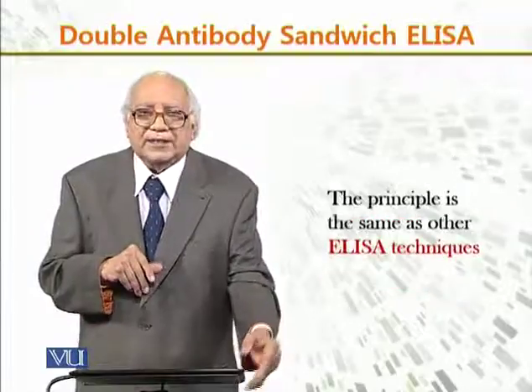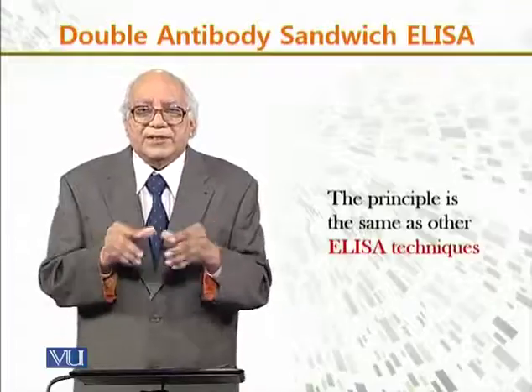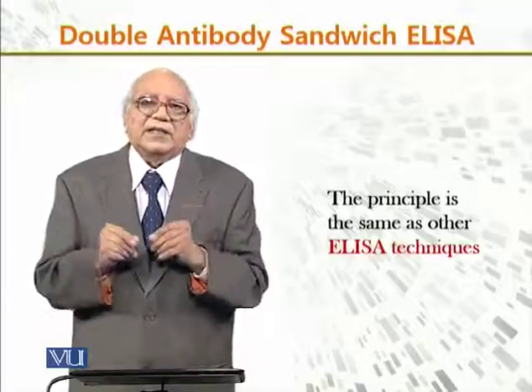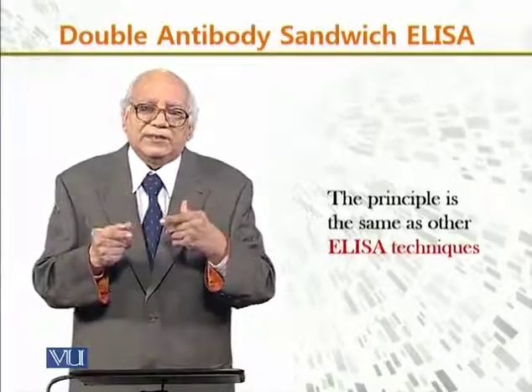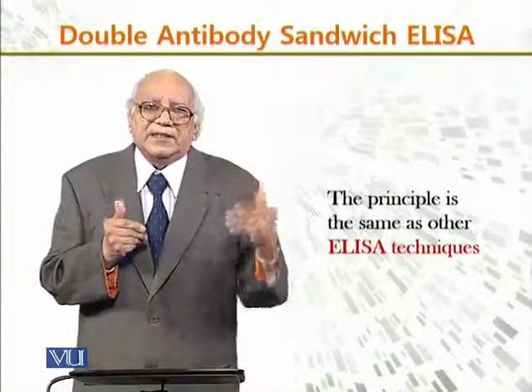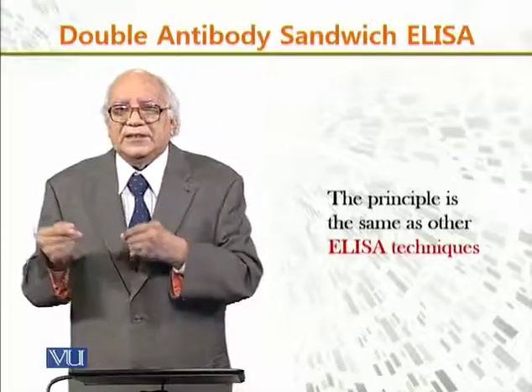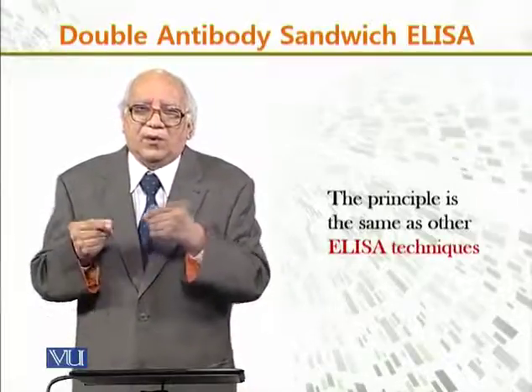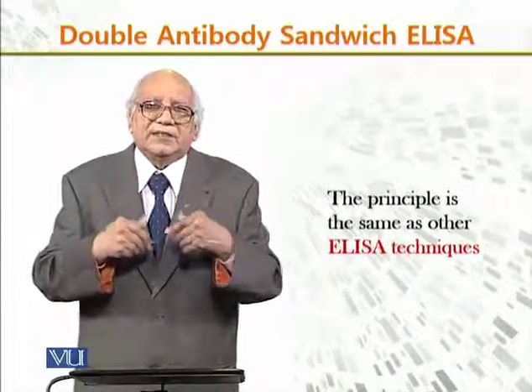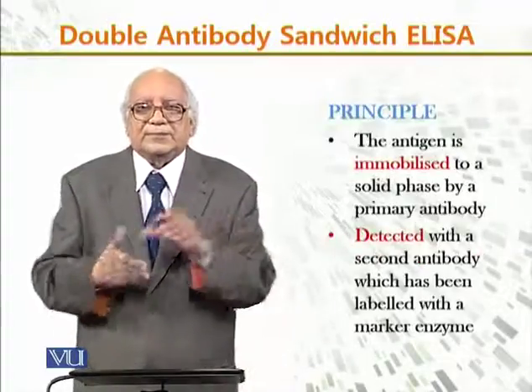Now, the principle of this technique is basically the same as other ELISA techniques, as we have seen in the previous diagram: the titer plate, the antibody coating, the antigen addition. The only difference is that we are adding another enzyme which gives the coloration, and from the coloration we can determine the result.